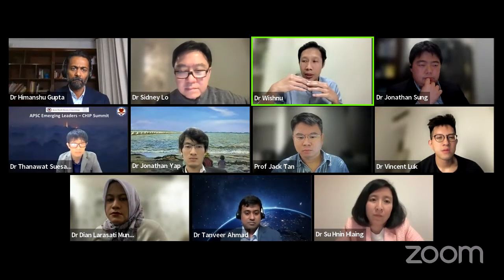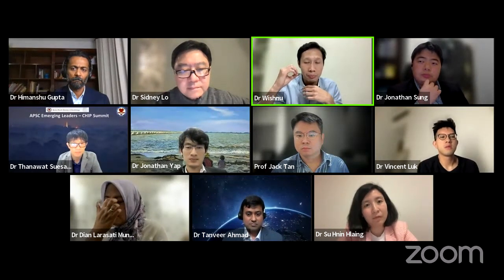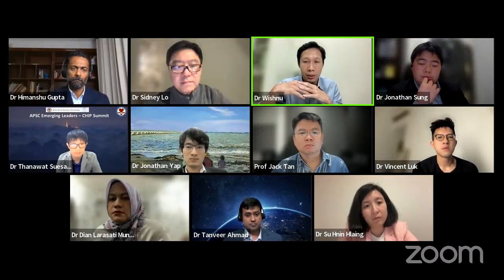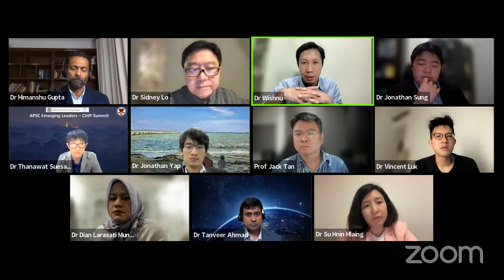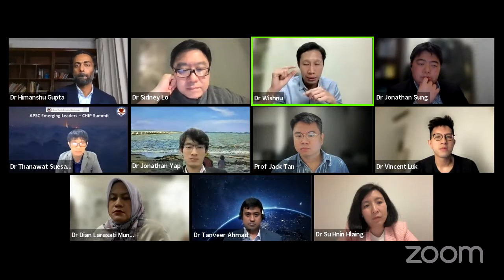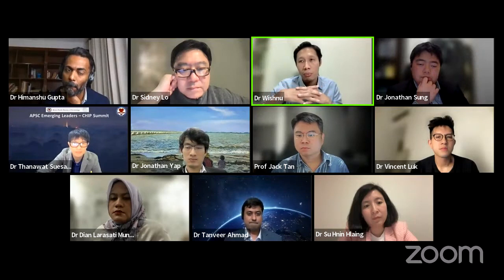It will not work really well when you have thick calcium, because it will only ablate the surface, starting from the surface. But in the case of nodular calcification, it will at least unsharpen the nodule. So you have very few burst balloon cases after you do orbital atherectomy. But the weakness of the orbital is that it needs a little space to start to rotate, so it will probably be ideal for a vessel of more than 2.0.